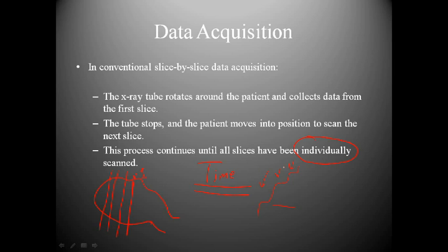And the ER physician calls over probably about 30 to 40 minutes after I'd already scanned the patient. The images had been sent over to PACS. And he asked if we can do 3D recons. And so I say that I really can't do that based on the type of scan that I actually performed. To do 3D reconstructions, I would have to take the patient back, scan them again, and pretty much manipulate those images and discard what I've already done.